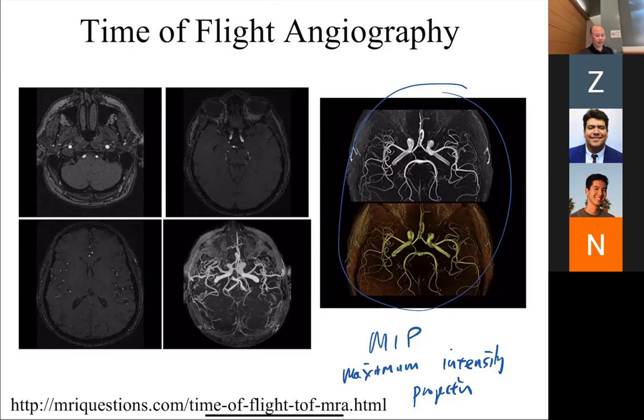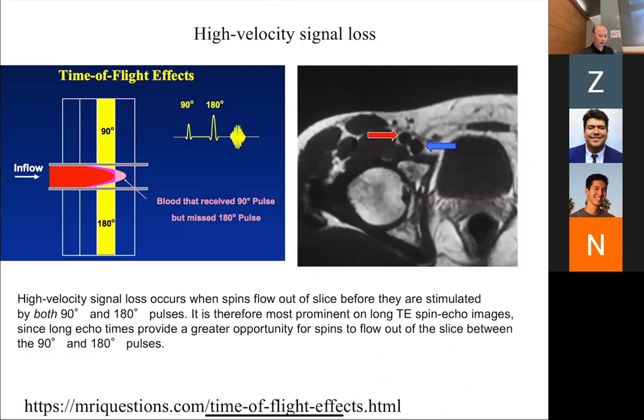And so the nice thing is this can be done without contrast. You can also inject contrast into the subject and make the T1 even shorter, and that can also help with the contrast.